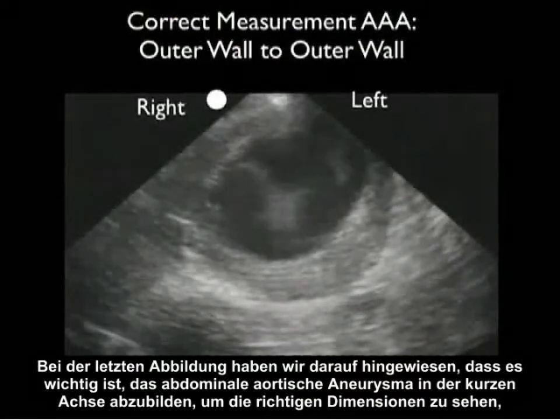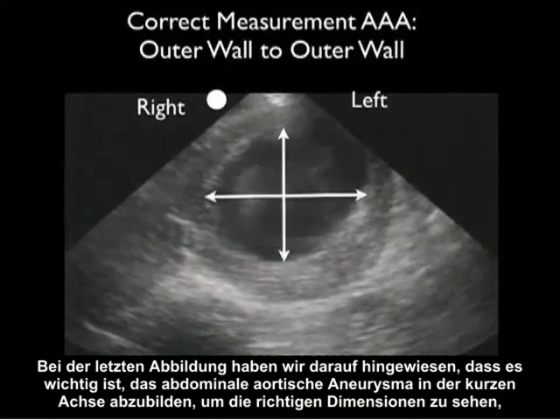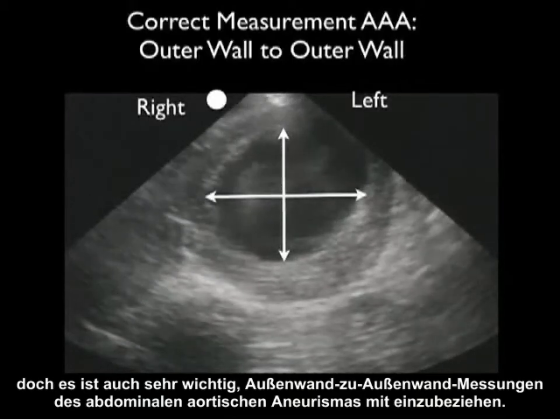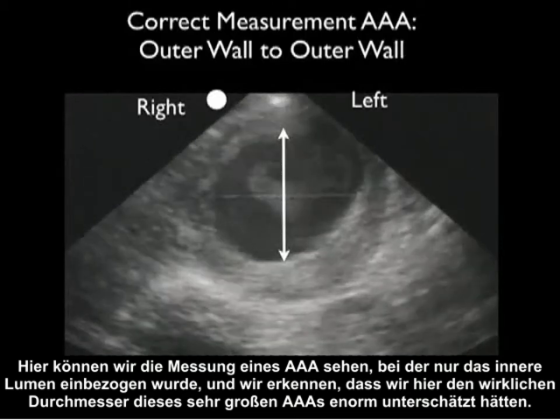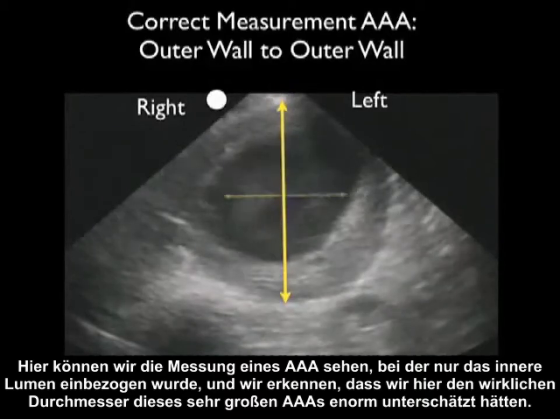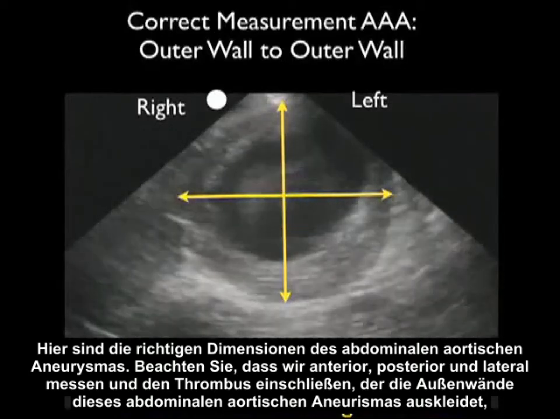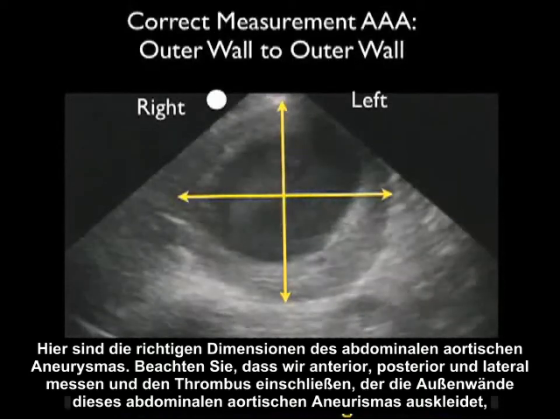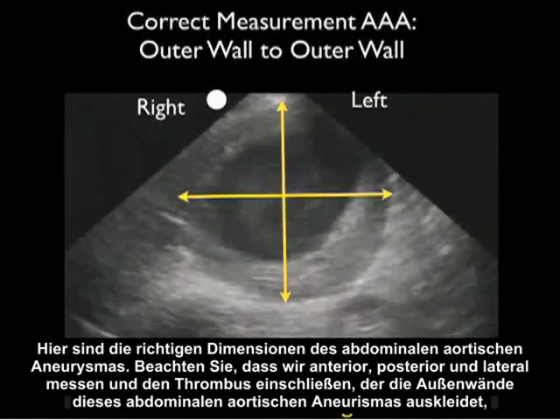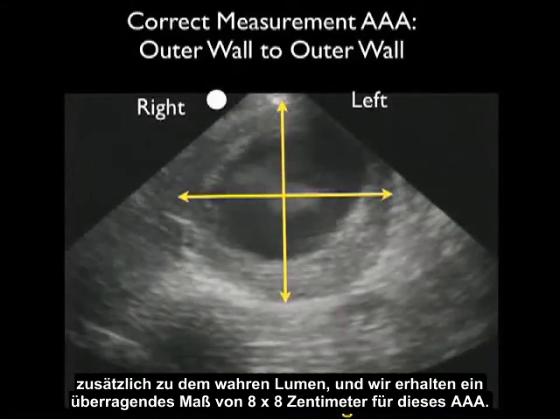It's important to image the abdominal aortic aneurysm in the short axis configuration, but it's also very important to include outer wall to outer wall in the measurements. Here we can see a measurement of a AAA including only the inner lumen, and notice that we could vastly underestimate the true diameter of this very large AAA. Here are the correct dimensions, measuring anterior, posterior, and laterally — including the thrombus that coats the outer walls — in addition to the true lumen, and we get a measurement of 8 by 8 centimeters.